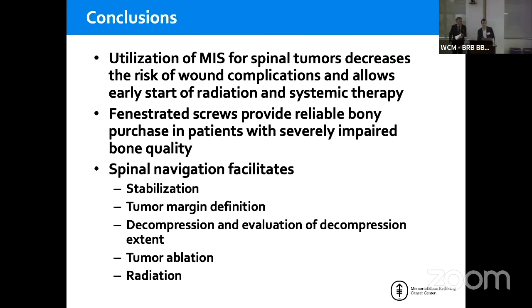Excuse me? What kind of percutaneous cervical screws did you use? Yeah, I didn't have a disclosure slide, but I've consulted for this company, it's called SpineWave. They have a new system that has extended tabs for the cervical system. So I've done a few cases. It's a work in progress, but I think, again, for these patients, it's pretty helpful, especially if we're talking about cervicothoracic, that tends to be the more symptomatic area for the open approaches. And I have a lot of colleagues who even up front use plastic surgeons, because that tends to be the area that falls apart the most. So I think if we can start applying percutaneous techniques to that stabilization, it would be really meaningful.